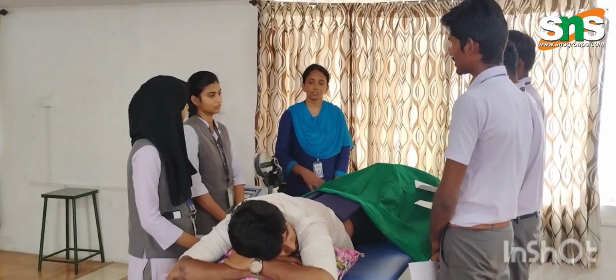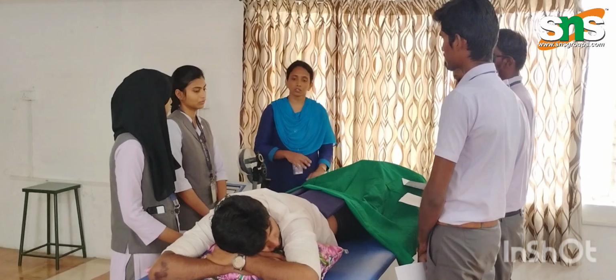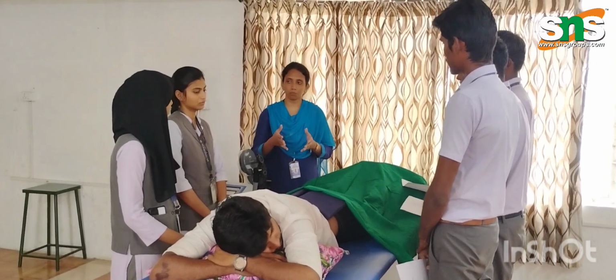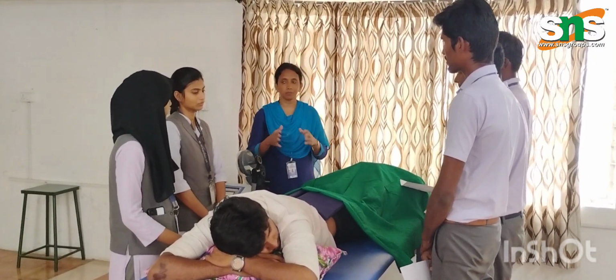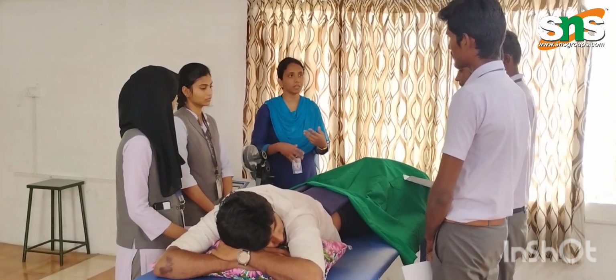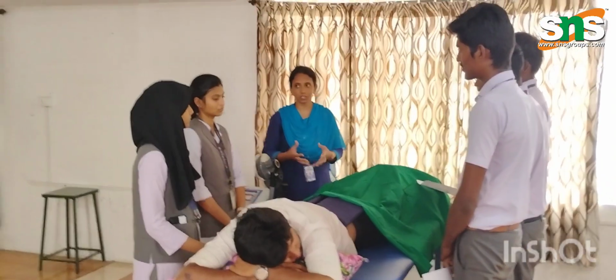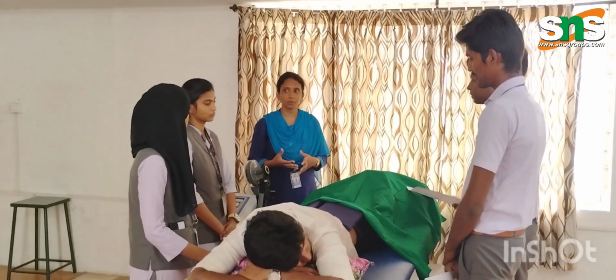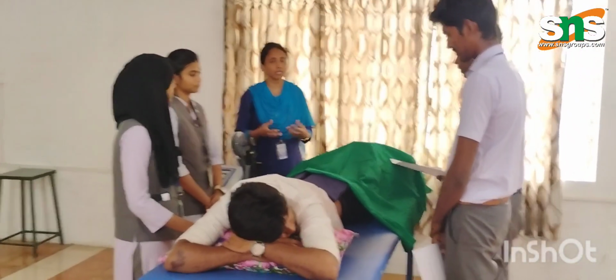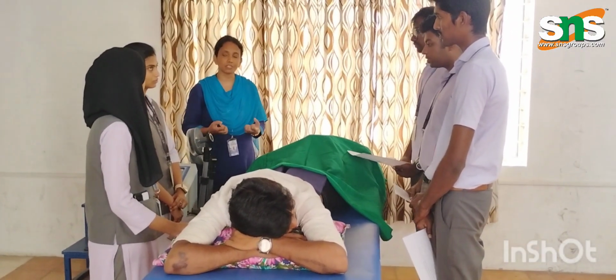As he told, the physiological mechanism of short wave diathermy in treating low back pain: the heat given by the modality penetrates deep into the tissue. Inside the tissue it increases blood flow, thereby increasing the oxygen supply and nutrients necessary for the deprived tissues, and that will enhance the tissue healing mechanism. Thereby the patient will have reduced pain sensation.